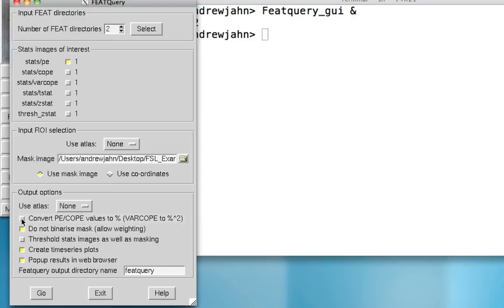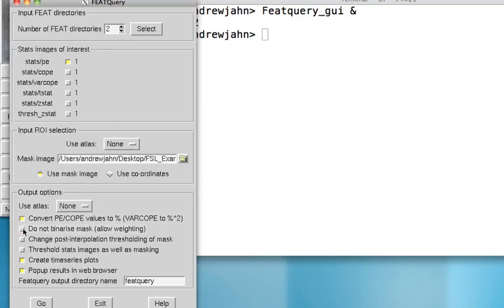So let's go ahead and click convert the PE to percent change. And also, we want to allow the binarization of the mask. In other words, we don't want to allow any weighting for this particular mask.